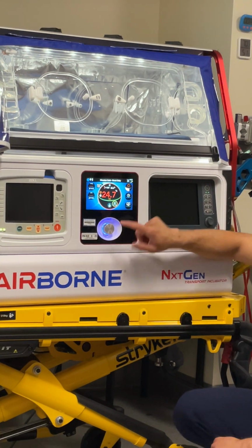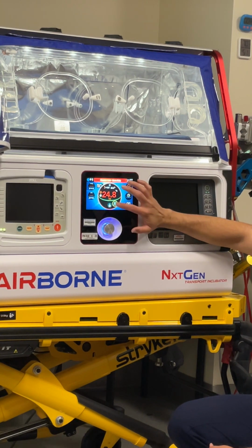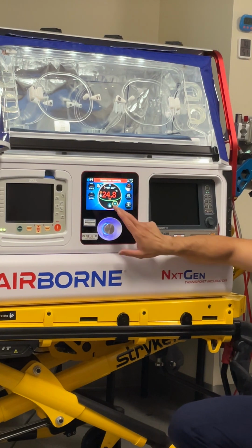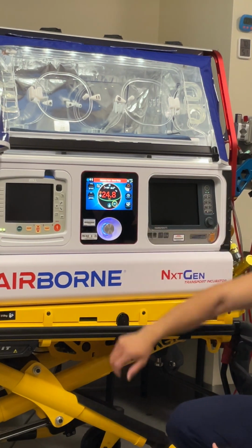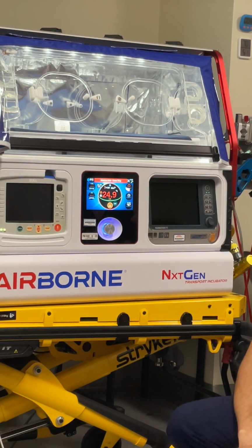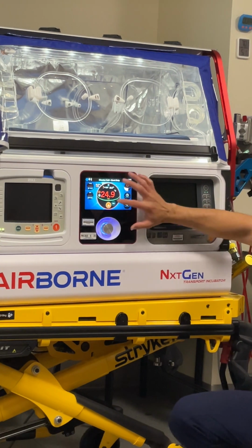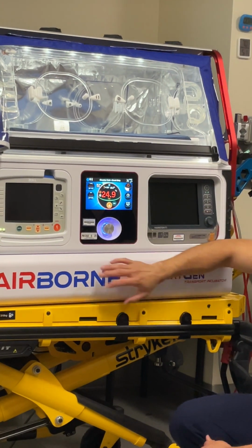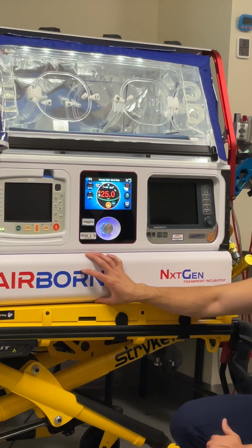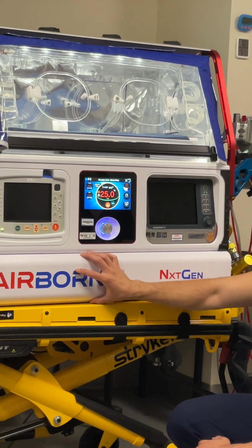And remember, we tap to turn on, but to turn it off, it is not a tap. It is a hold. This is that little button for the heater on the mattress. If I turn that on, it starts the mattress heater. And it's not a heater like a heater. It just gets it so it's not cold. Don't rely on it to keep your baby warm. But you can put a 23 weeker on it and it's not cold.